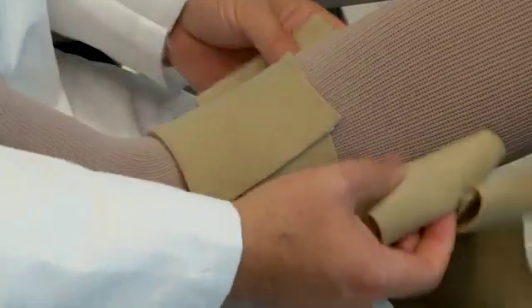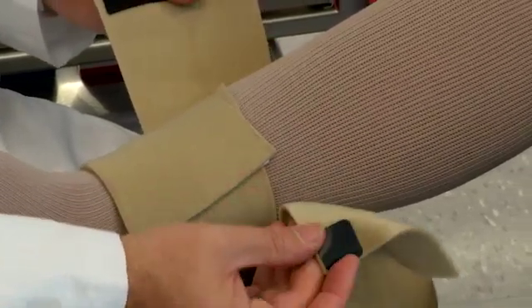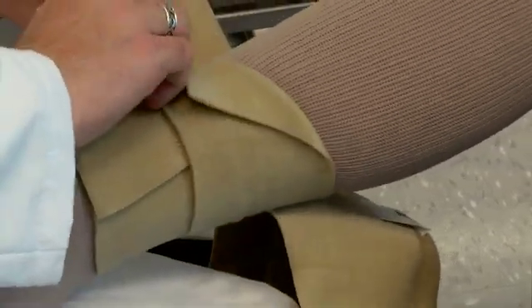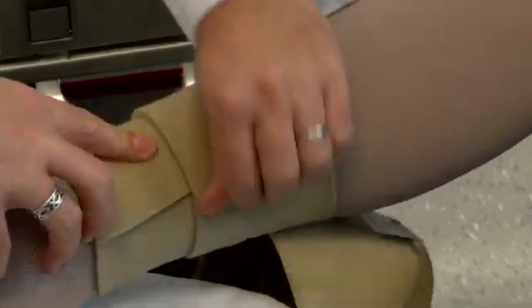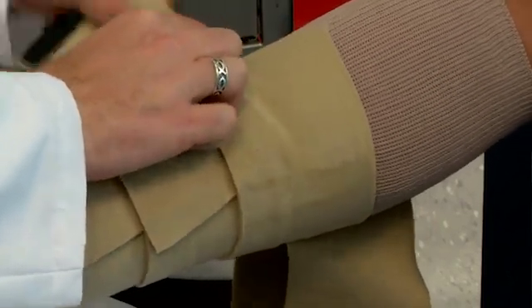The Farrah Wrap Basic is also the most cost-effective Farrah Wrap. Another feature of the Farrah Wrap Basic is that we have small tabs on the inside. These tabs can also be removed if you do not want them, but they have the additional benefit of allowing you to apply the band with one hand. This can be pulled to end stretch and put in place, and then the next band layer can be applied.